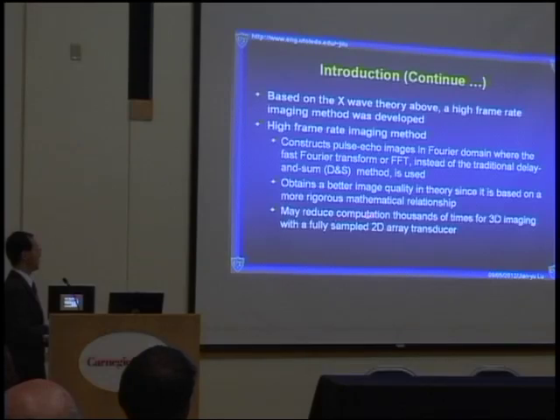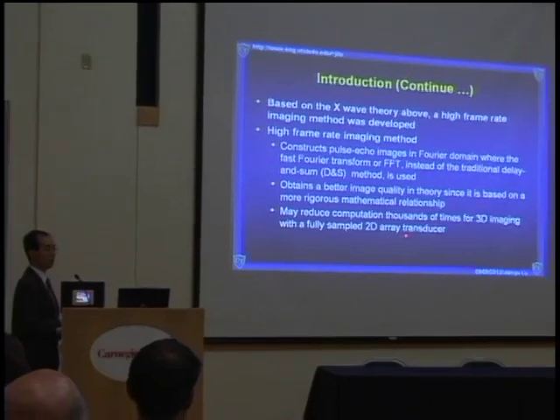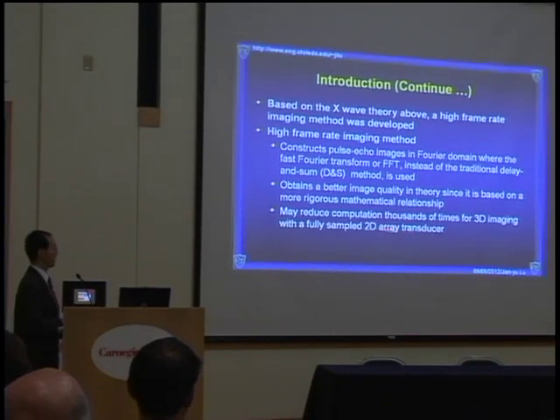And it may reduce the computation thousands of times in three-dimensional imaging using fully sampled 2D arrays, as compared to the conventional delay-and-sum imaging method.